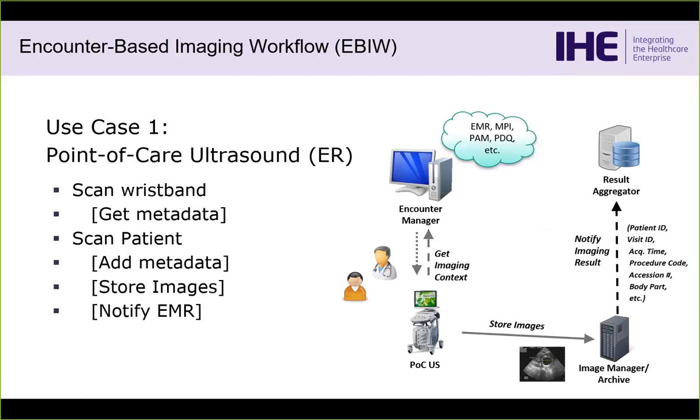In the case of encounter-based imaging, it doesn't know that any imaging has been done yet. And so the notify message, which is an HL7 ORU, we wanted to keep these as compatible with current systems as possible, contains all of the information you see on the right: the patient ID, the visit ID, the acquisition time, etc. And the point there is a lot of EMRs will create a phantom order or a proxy order because they like using the order structure to manage studies and to link them into the medical record.